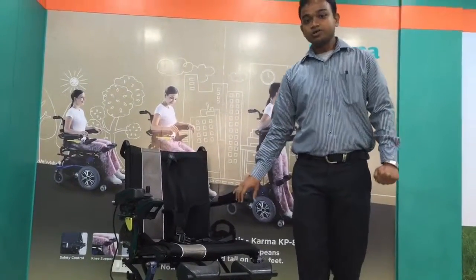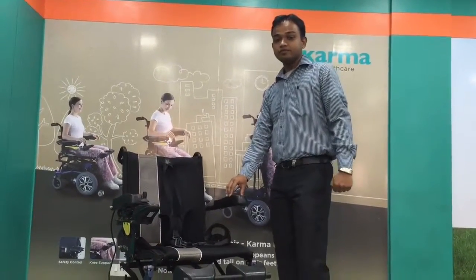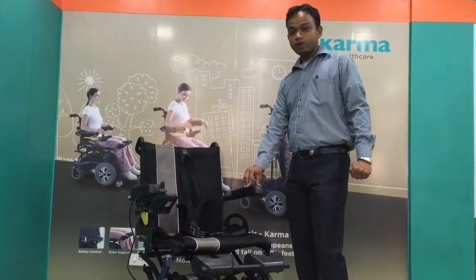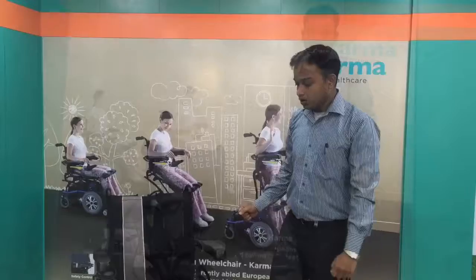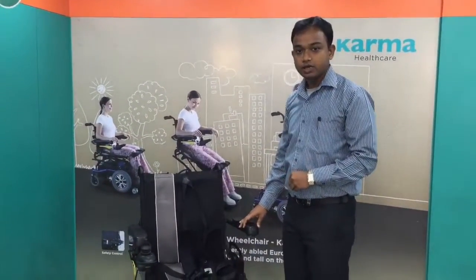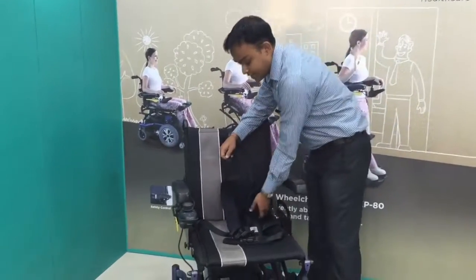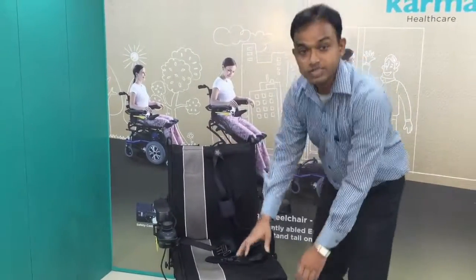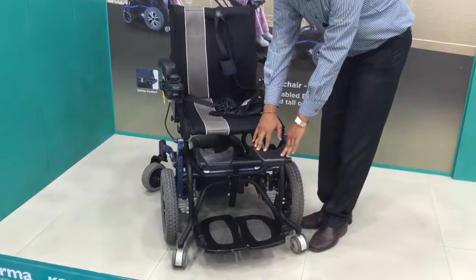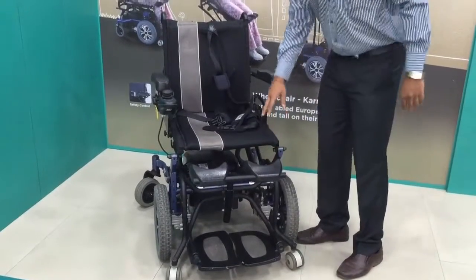Like the other models, the Karma KP80 comes with standard and safety modes. Today we are going to give you a small demo about the KP80. It comes with an L-shaped safety belt with knee support, which supports your lower limbs so that it maintains the stability of gravity and also prevents accidental sliding.